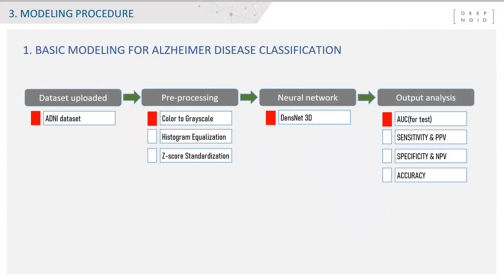Here is the way of the building process of DeFi, representing how to build our deep learning method. For the first stage, we uploaded the ADNI dataset on DeFi and then applied two image preprocessing steps. In this image preprocessing stage, we used three kinds of image preprocessing functions provided by DeFi APIs. One of them is color grayscale conversion to convert to 8-bit grayscale images. The second is histogram equalization to add maximum contrast effect. Thirdly, Z-score standardization was applied to maximize the efficiency of feature extraction.